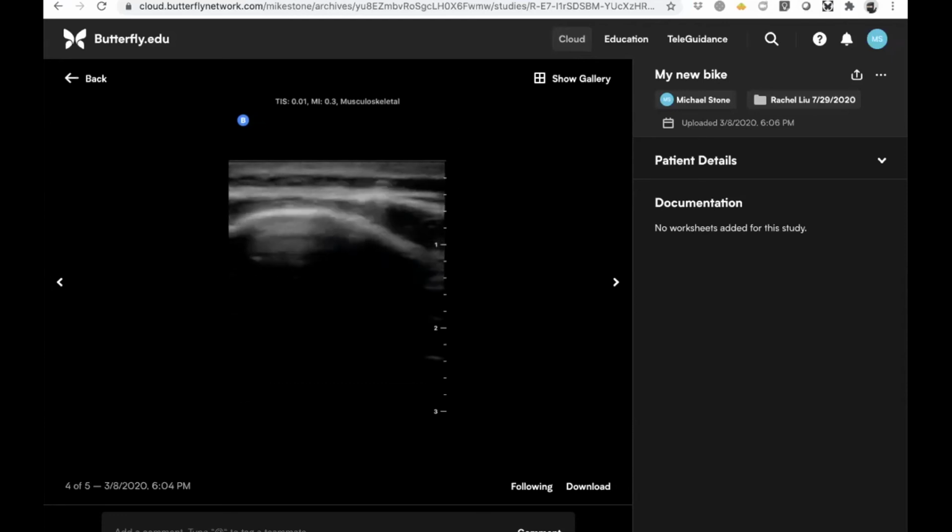And the difference between chest X-ray and ultrasonography for rib fracture is mind-blowing. These data go back to the 1990s in the American Journal of Roentgenology. This is not a point of care application that a bunch of enthusiastic ER docs came up with. You're looking at 8 to 10% of rib fractures detected on plain chest X-ray in some studies, and 80+% detected with sonography.